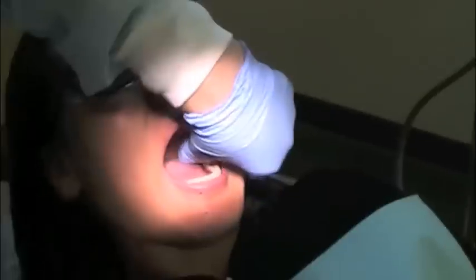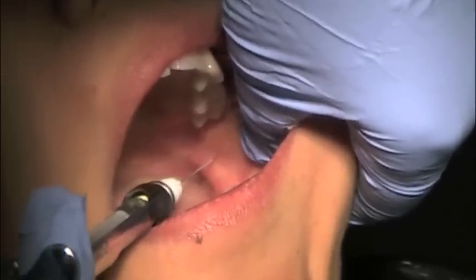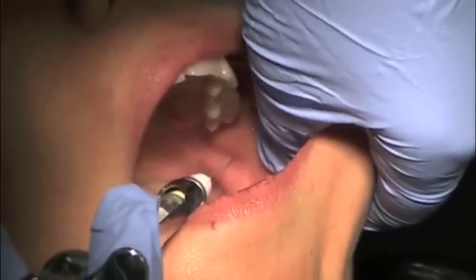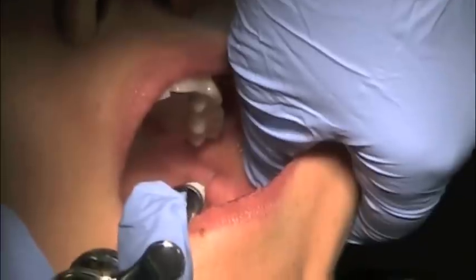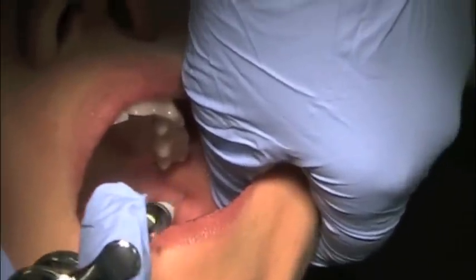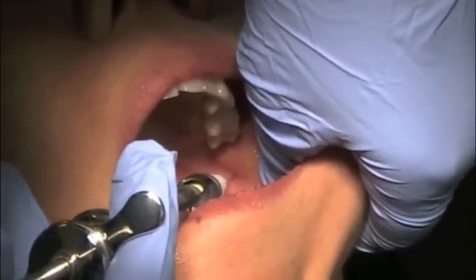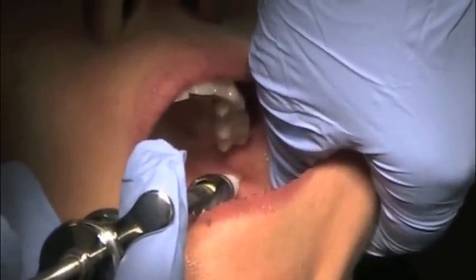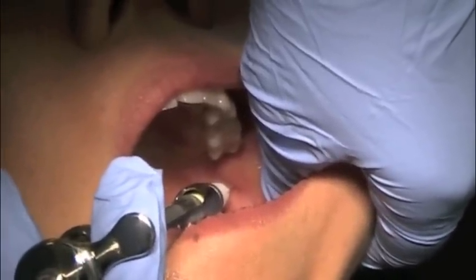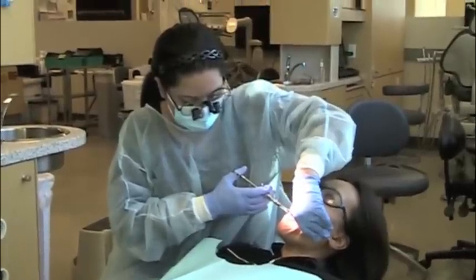Before inserting the needle, use 2x2 gauze to dry the tissue. Then place the syringe at the opposite corner of the mouth. Then insert the needle until osseous contact is achieved. It will be about 25 mm in depth. Then aspirate twice in 2 planes. Keep your thumb at the coronoid notch all the time.